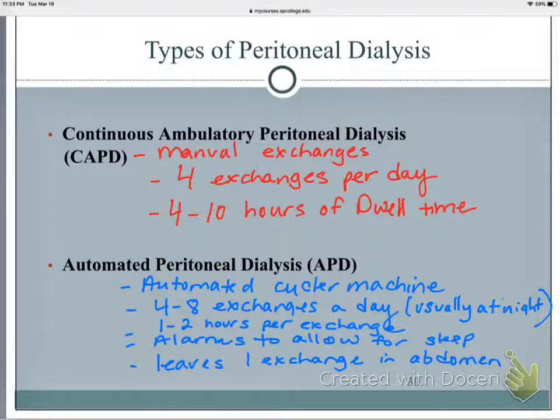The big important thing with peritoneal dialysis, and I would focus on this, is maintaining aseptic technique. Right? Because otherwise what happens? Peritonitis, right? So critical with these lines and disconnecting and reconnecting, aseptic technique is critical. And I would focus on that.